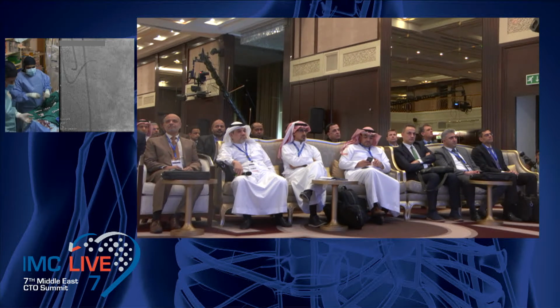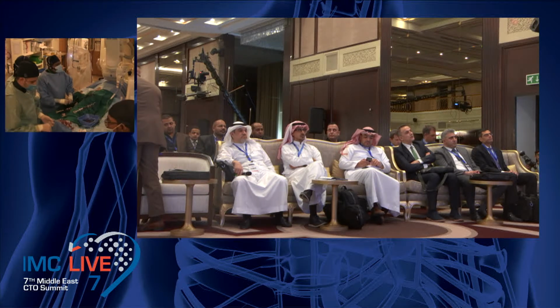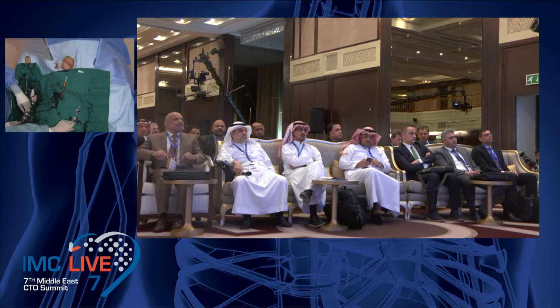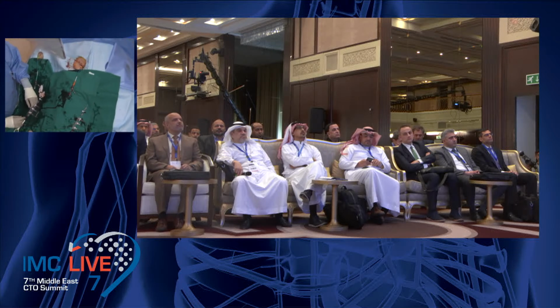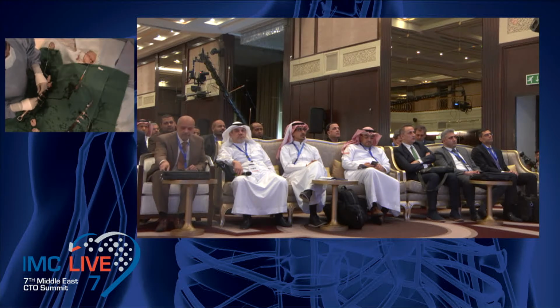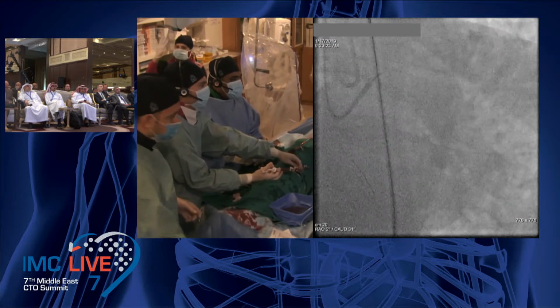So could you just show us again the spider view, please? Yes, can you go to spider, please? Before, no. I can give you another image with a spider. Okay, so go there to spider. Wait, just a second. I just put in my wire and will show you the spider again.